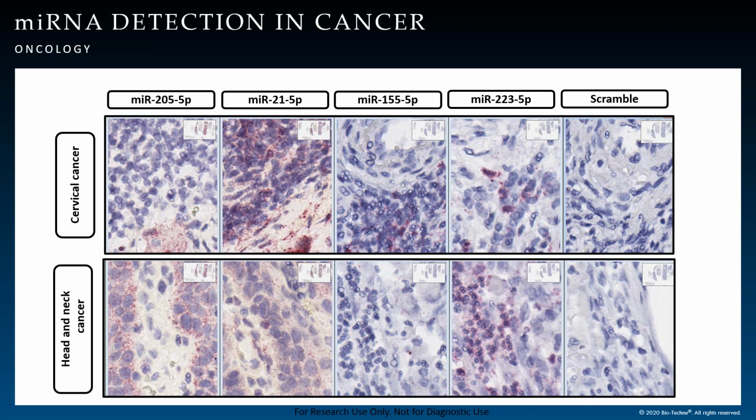Next is miR-21-5P, and this is one of the earliest identified cancer-promoting microRNAs, or as they commonly refer to them as oncomiRs. And the way miR-21-5P acts is by activating the PI3-AKT pathway, again, activating cell proliferation, and also by enhancing oncogenic KRAS activation.